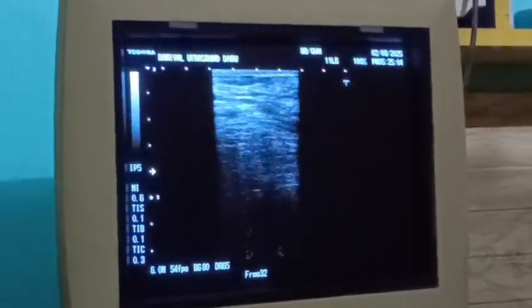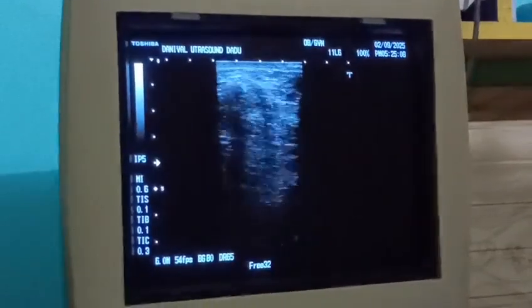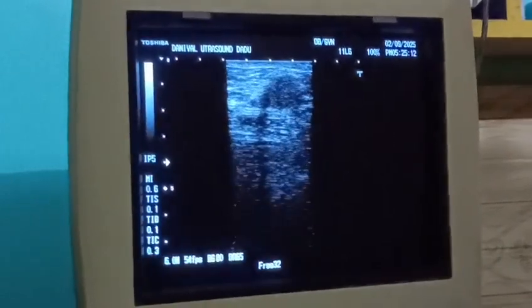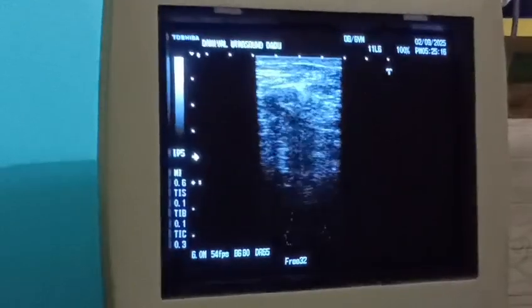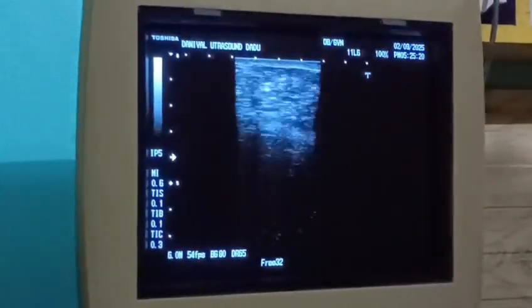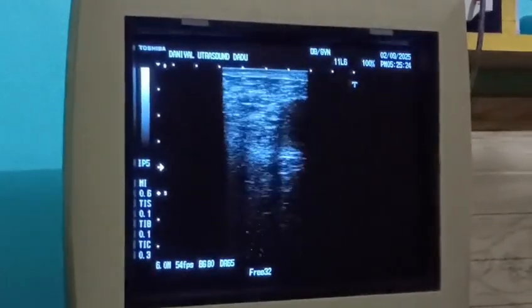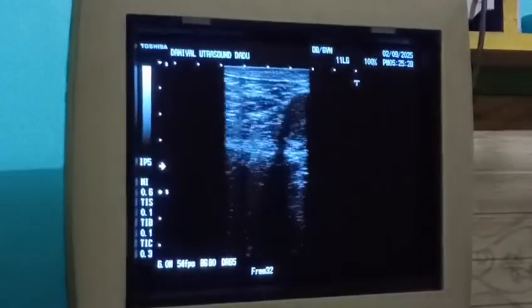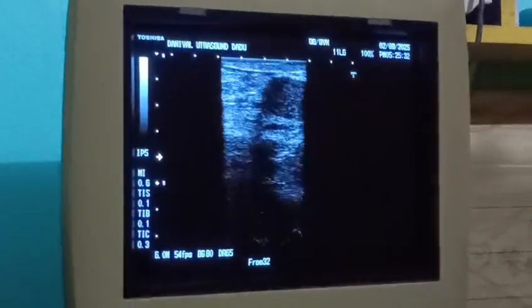So, this is showing no peristalsis at all. So this is omental hernia or fat, where there is no bowel loops inside it. And though it is not quite fully reducible, it's partially reducible and showing no incarceration or strangulation. However, it is omental hernia, maybe due to carrying weight or anything else like that.